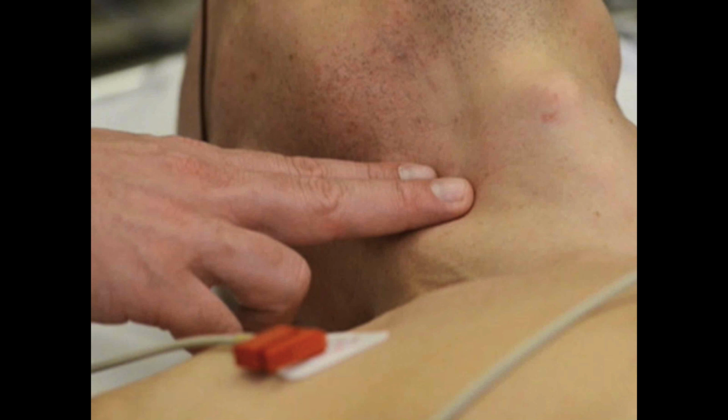So I submit to you that another way we can really help with ultrasound is identifying rhythms like ventricular fibrillation that we may have not found otherwise, shocking them out of it, and turning that into a perfusable rhythm. Also identifying pseudo-PEA, or just patients have really low blood pressure, and trying to treat that underlying cause, or at least helping that guide us in our resuscitation. And so that when we're calling things cardiac standstill and declaring the patient dead, we're really making the correct interpretation.